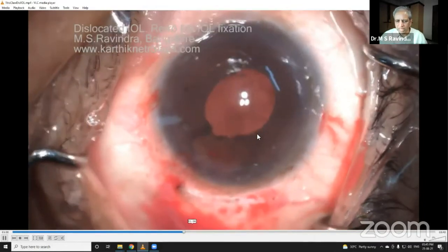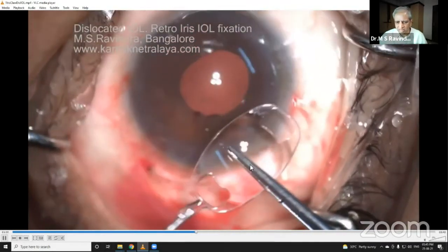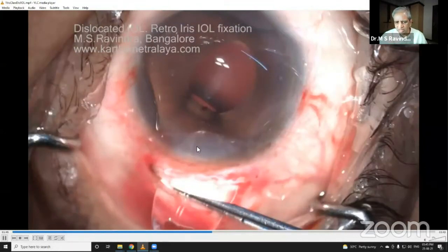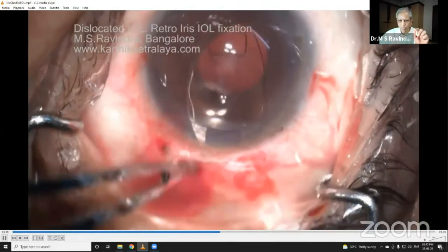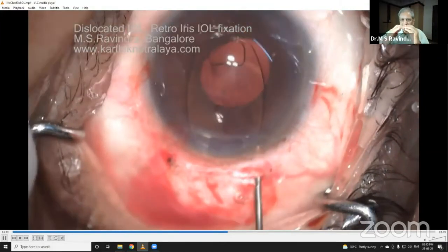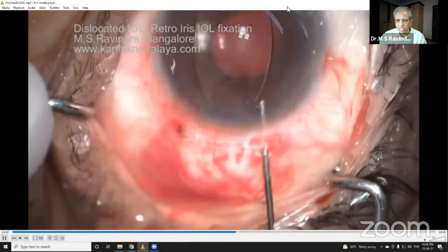The lens of my choice is one that can be fixed on the back of the iris. Always check that the slits on the haptics are intact — sometimes they are connected to each other. I move one of them very minutely so that if it gets separated, that means it's open. Then I gently keep it in the anterior chamber.